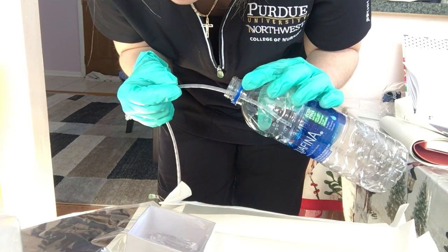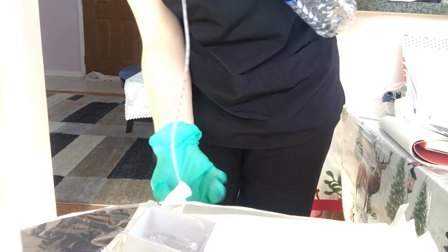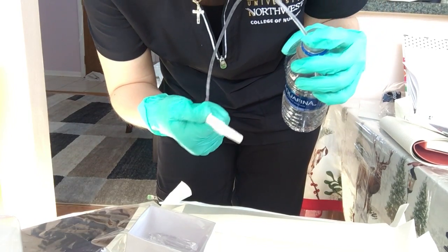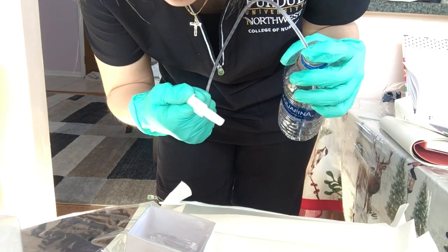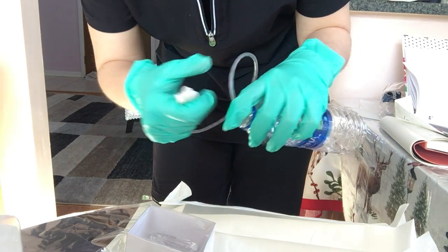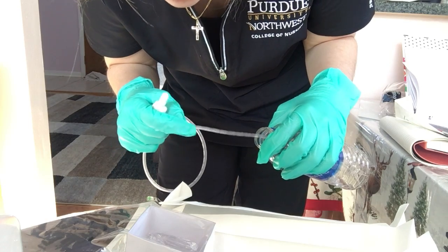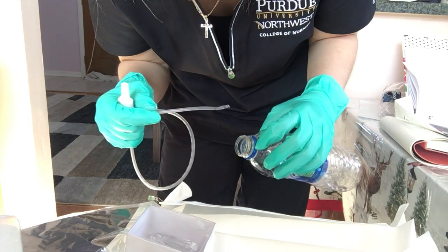Alright, so then we would apply suction intermittently. So this is when we would take the Y port and apply the suction intermittently. And we would gently rotate the catheter as it is being withdrawn. And we have to make sure not to suction for more than 10 to 15 seconds at a time.